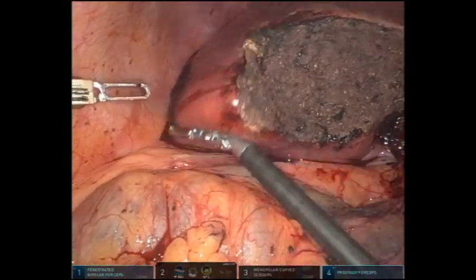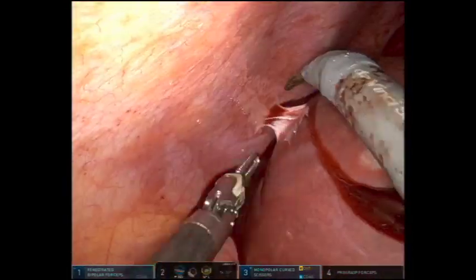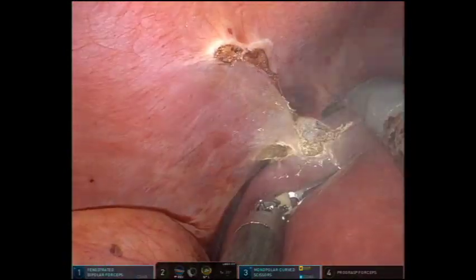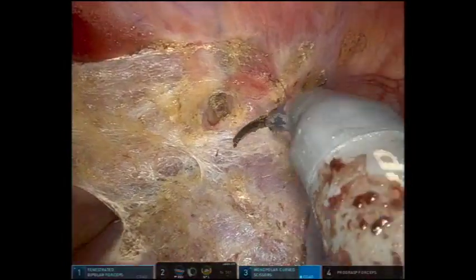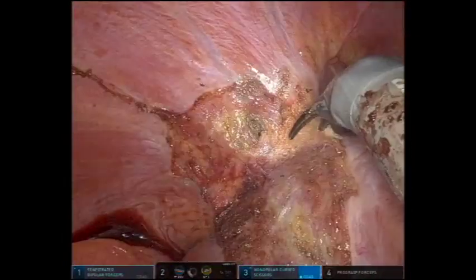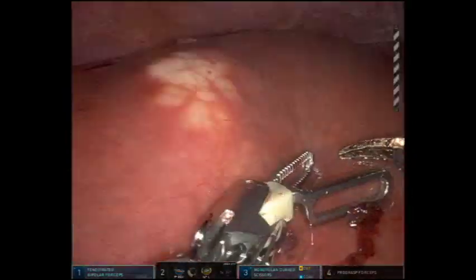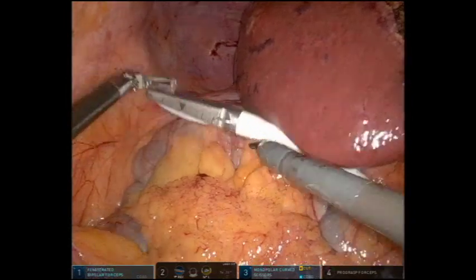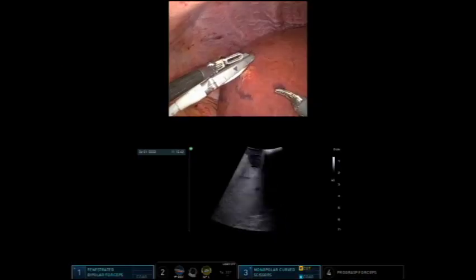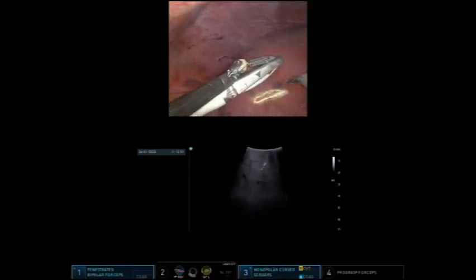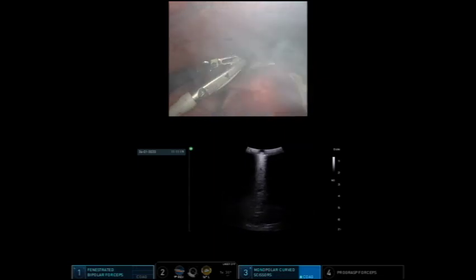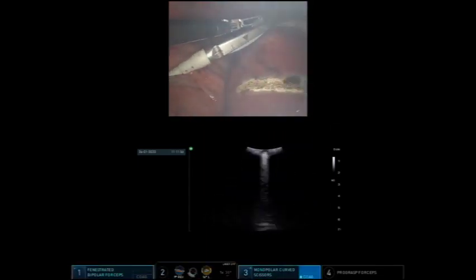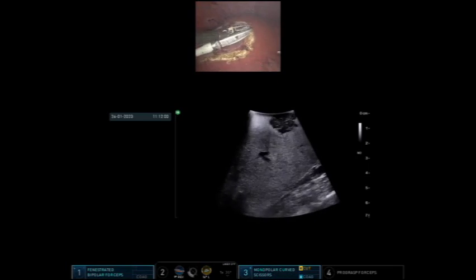Attention is then directed towards segment 6. The attachments between the liver and the abdominal wall and the liver and the diaphragm are taken down sharply with the scissor. The ultrasound probe is then dropped into the abdomen through one of the port sites, and ultrasound-guided imaging is used to visualize the hepatic tumor. A negative margin is made around the mass using the cautery.